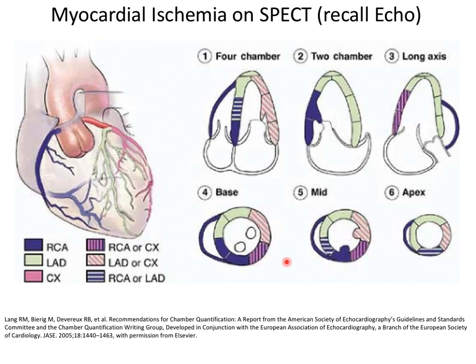In terms of making a picture, this is obviously very low resolution, with a chunk that is this big. So nuclear medicine squeaks in and can do this kind of resolution. Like if you're missing this chunk up here because the LAD is tight, you would expect that all of this stuff would be relatively diminished signal intensity.